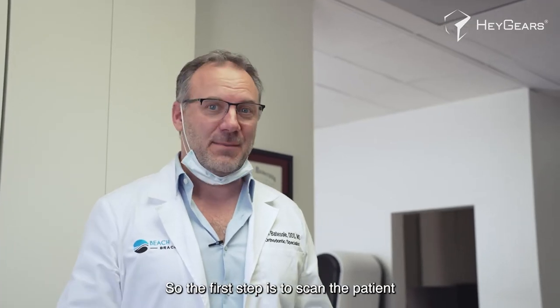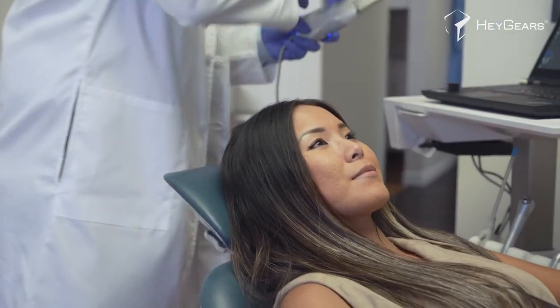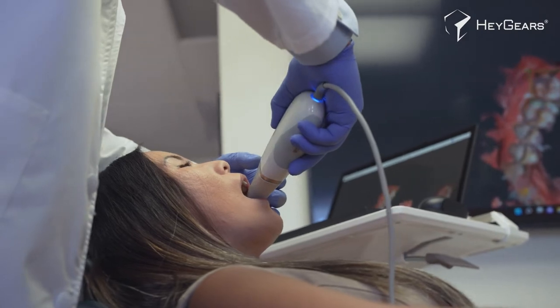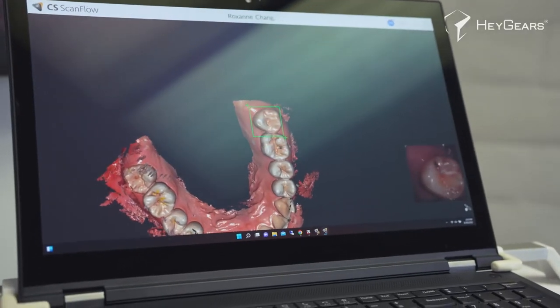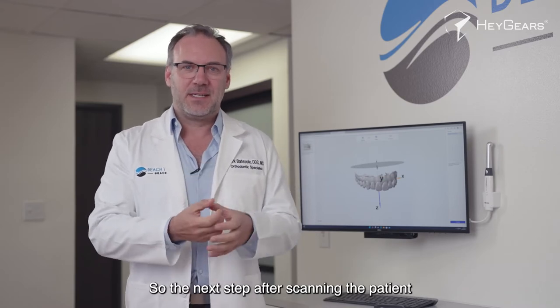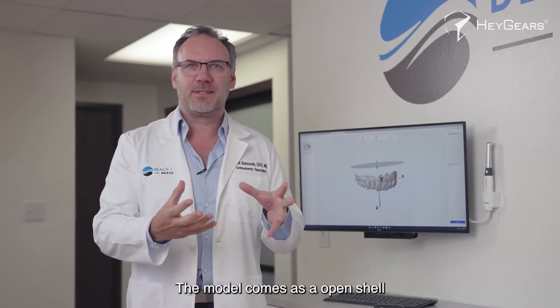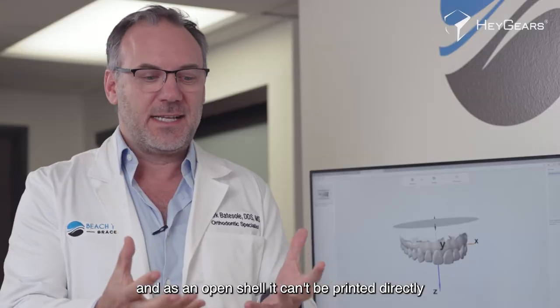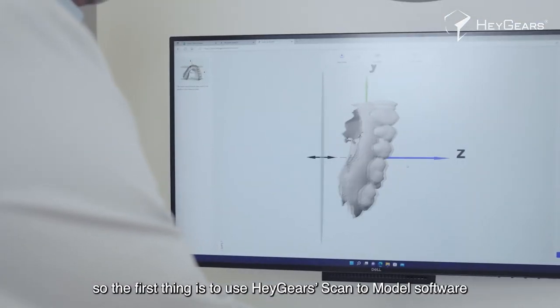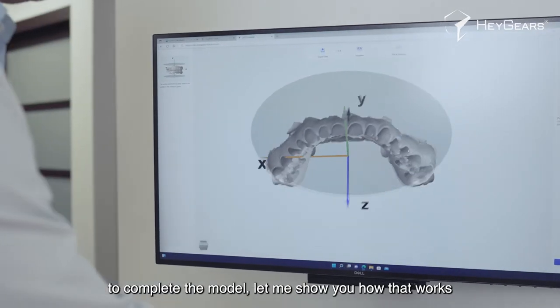The first step is to scan the patient. The next step after scanning is to complete the model. The model comes as an open shell, and as an open shell it can't be printed directly. So the first thing is to use Haygears scan-to-model software to complete the model. Let me show you how that works.